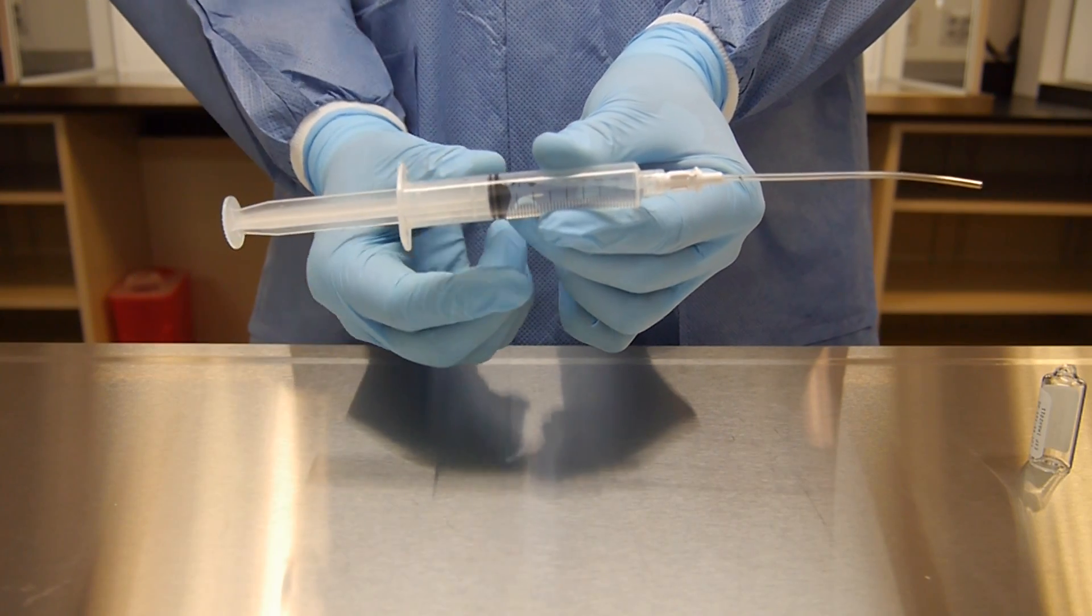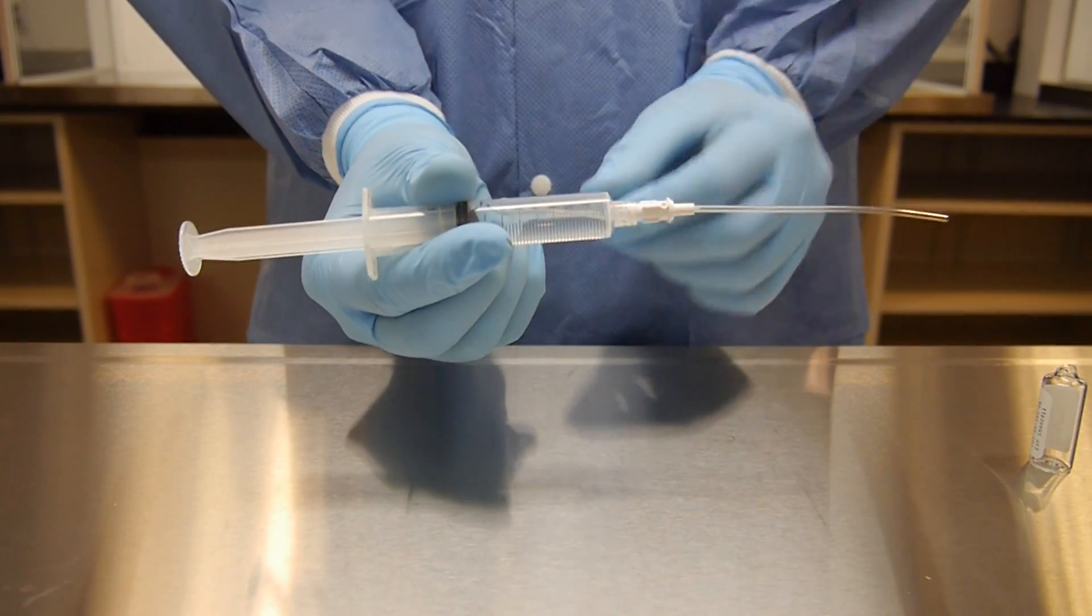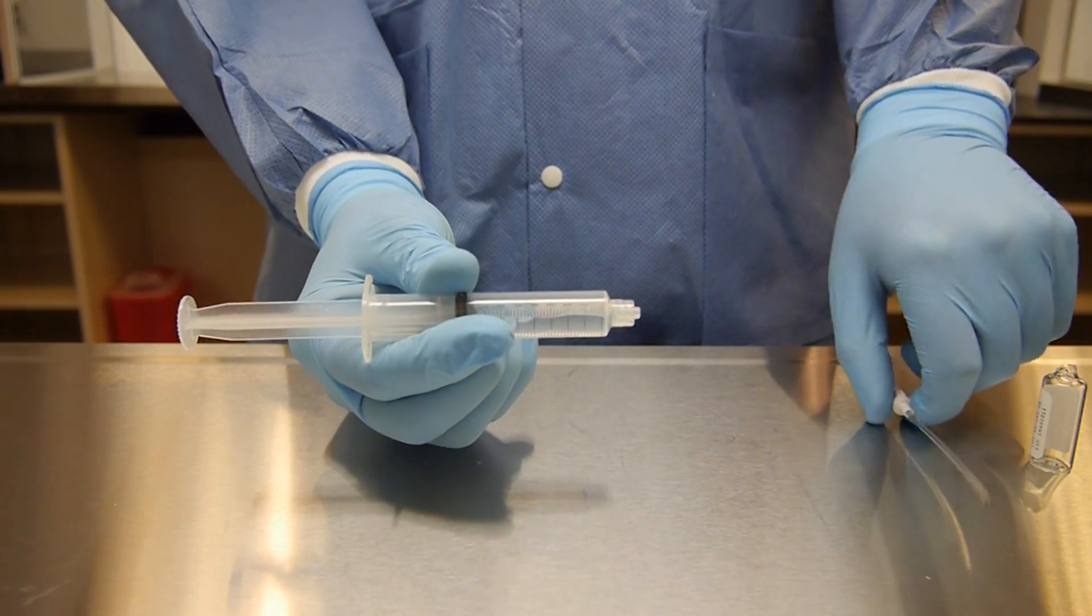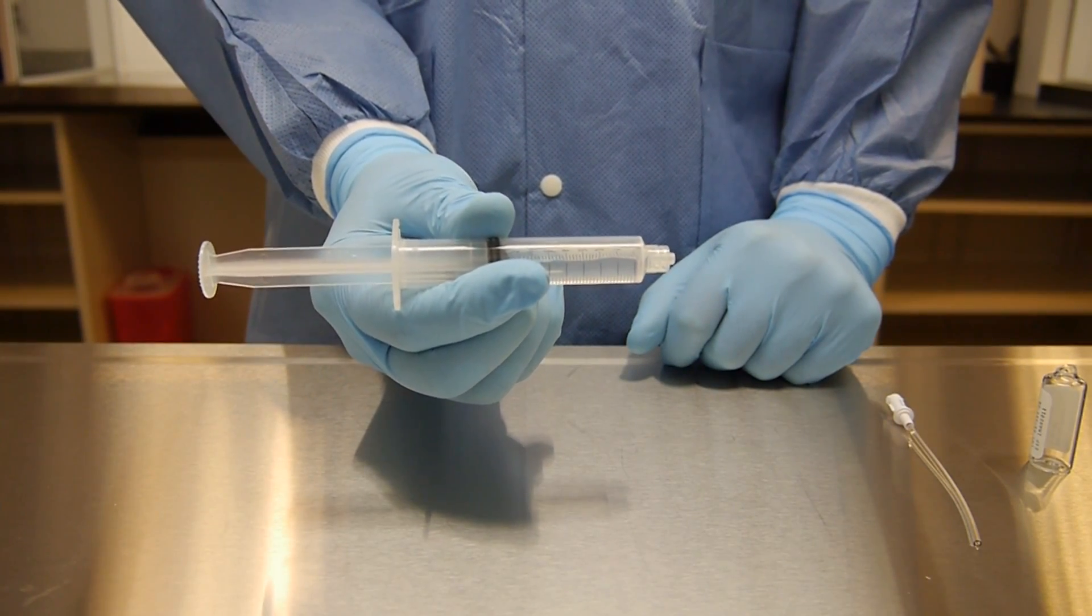Also, for safety purposes, avoid manipulations around the open ampule to prevent cuts. At this time, the filter straw should be removed and a regular needle or syringe cap should be placed on the syringe for further manipulation.